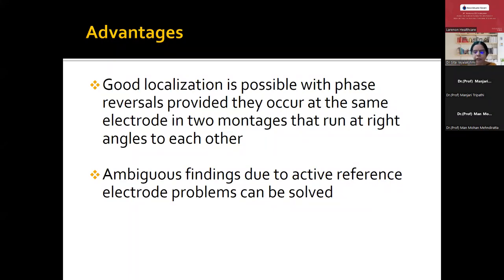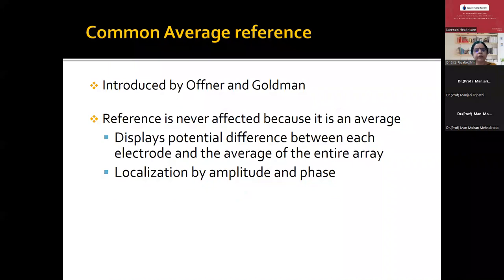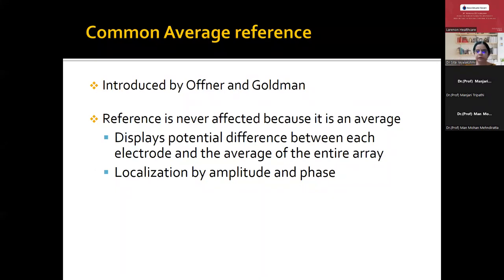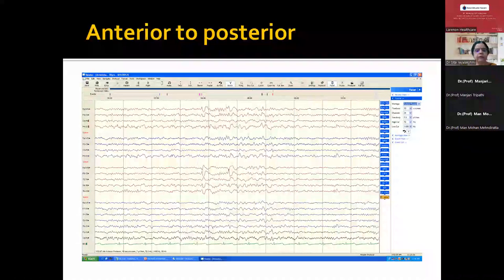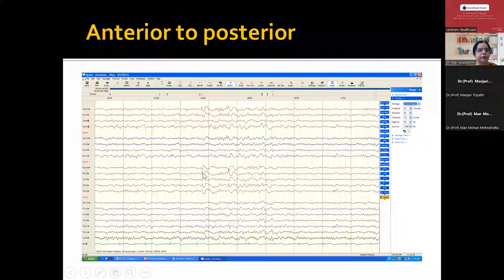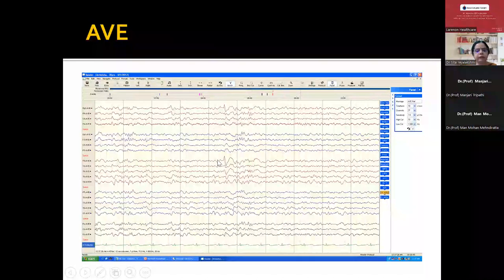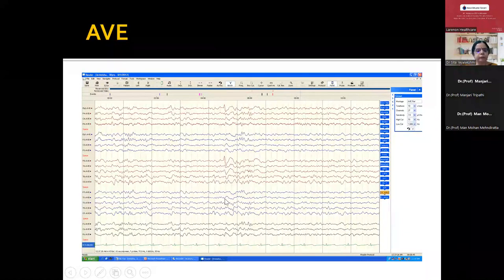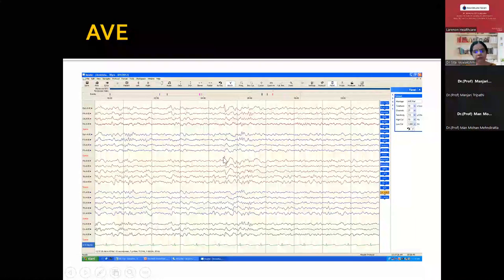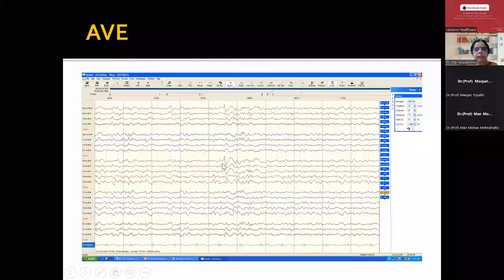If you identify a phase reversal both in a longitudinal and a transverse montage in the same electrode, you are 100% sure that the epileptiform activity is close to that electrode. Another important montage is the common average reference montage, which displays the potential difference between each electrode and the average of the entire electrode array. For example, Fz versus the average of the entire longitudinal array will be calculated. This is an example of an anteroposterior montage showing spikes with maximum surface negativity at F8. In the average montage, you can see nicely the maximum surface negativity at F8, though there are spikes at Fp2 and T4 as well — so this is coming from the right temporal lobe.